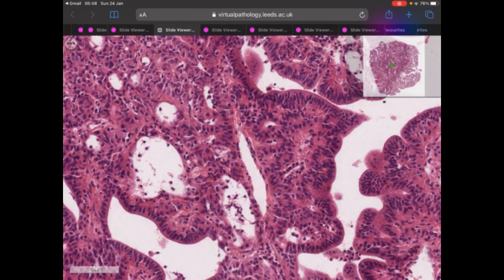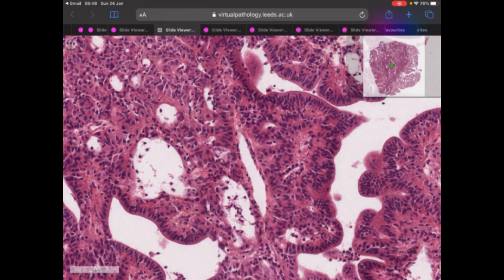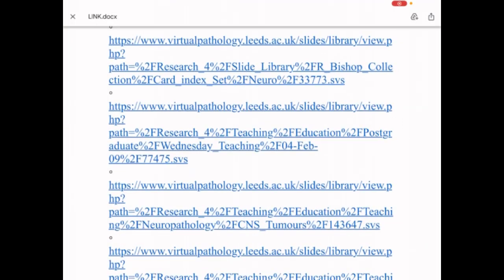So at the center here, this is a papilla. This is a papillary core composed of fibrovascular core, fibrous tissue with blood vessels, and these papillary cores are lined by these neoplastic cells. So again, this is a very prominent papillary core. We can appreciate the papillae, and they are all lined by a single layer of neoplastic cells, and all the areas show us similar features.